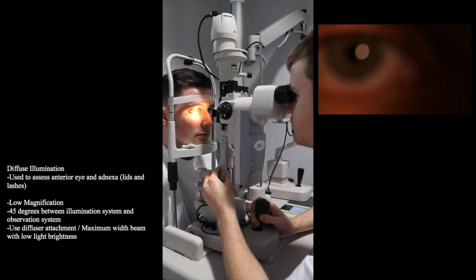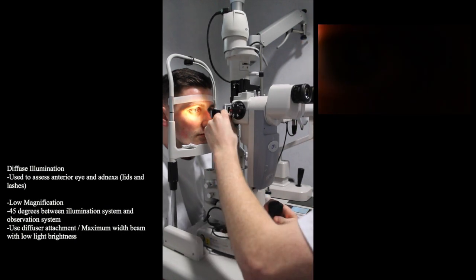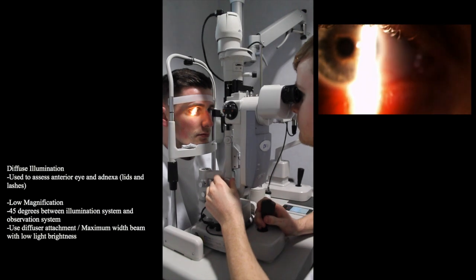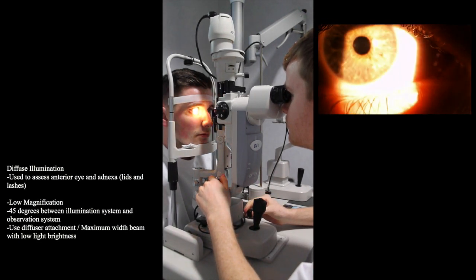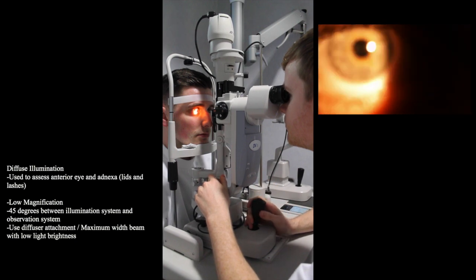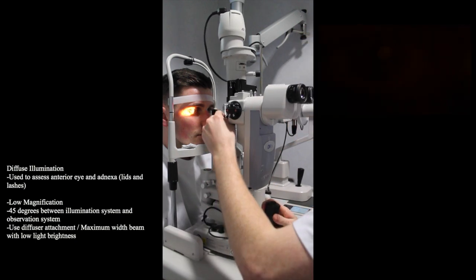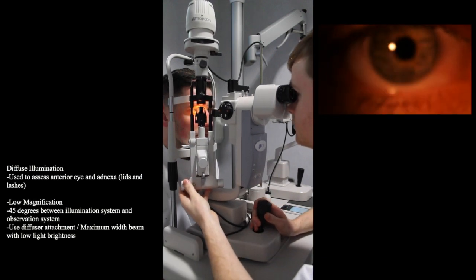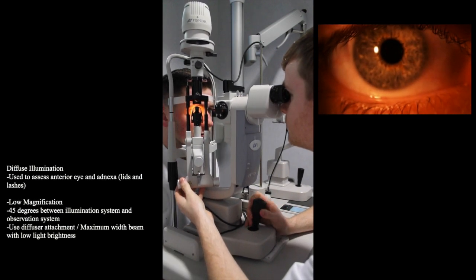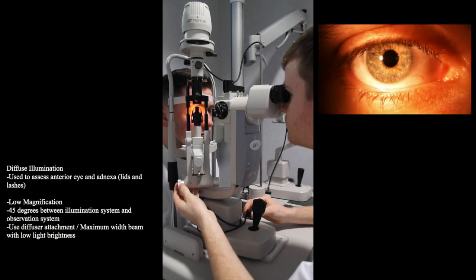If your slit lamp doesn't have this diffuser attachment, a similar illumination can be gained by increasing the slit width to its maximum and decreasing the brightness to prevent patient discomfort. Today we will be using the diffuser. Adjust the illumination system and observation system so they are 45 degrees apart. Set the magnification to low and have the overall illumination of the eye at a moderate level.